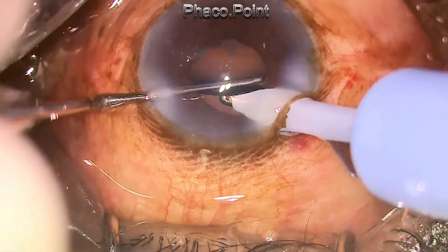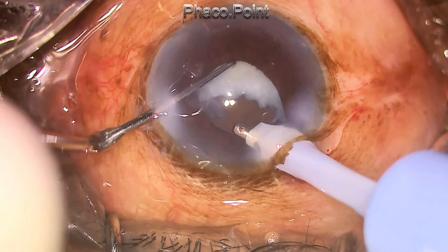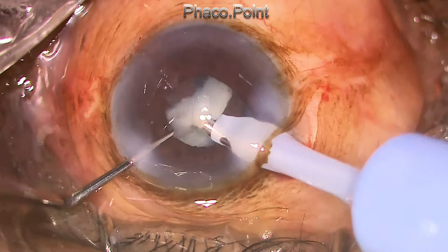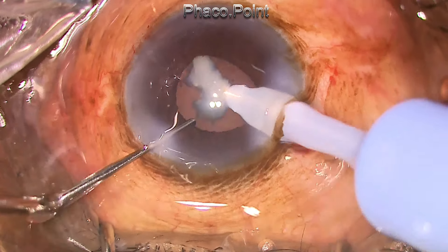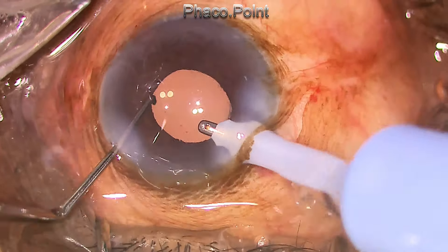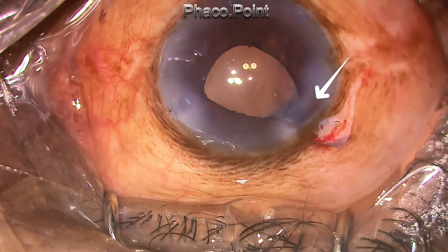The entire cortical girdle that was stuck to the equator, trapped between the peripheral part of the anterior capsule and the posterior capsule, got completely dislodged when the haptic was swept underneath it and pivot rotated. The whole complex could then be removed easily. This technique is considered safe and does not create any stress on the zonules. Upon taking the coaxial irrigation-aspiration handpiece out, iris incarceration is found.